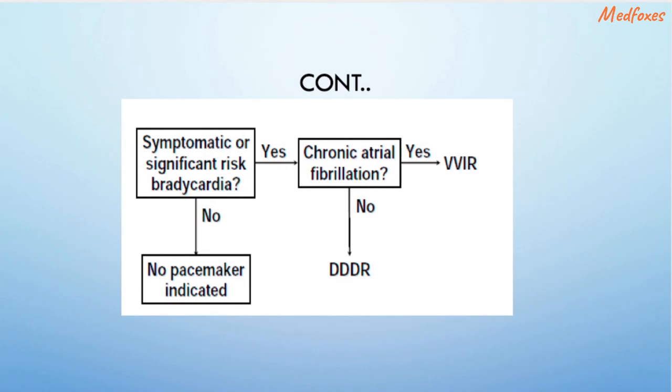For example, in patients with other irreversible medical problems, in whom longevity or activity level or both is markedly limited, a simple device may be most appropriate. This decision must be made individually.